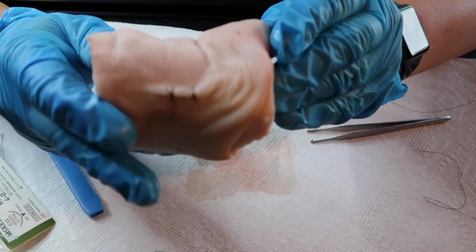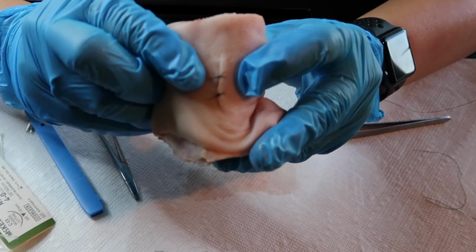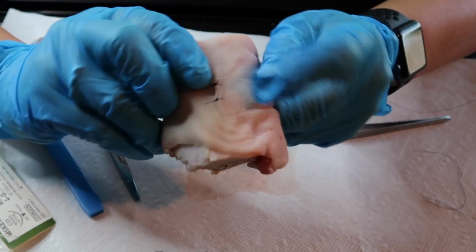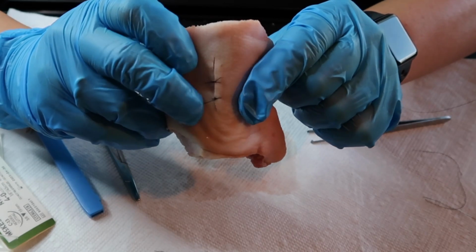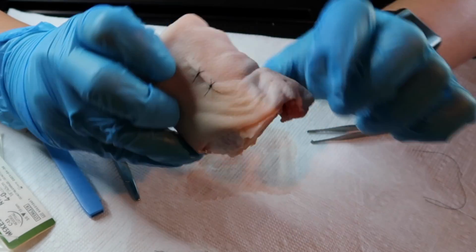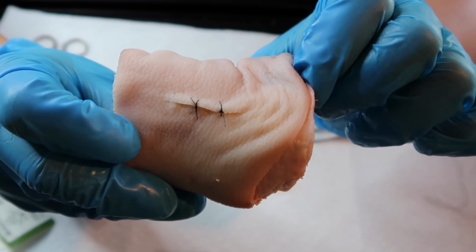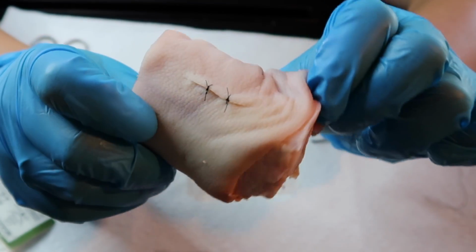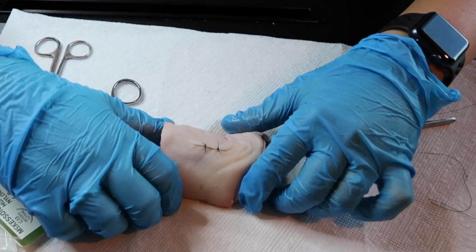So as you can see, we've got our internal sutures and our external simple interrupted sutures here. Ran out of stitch, so I probably would have done 1 to 2 more stitches on each side just to make sure that this stayed closed up, but that's okay. Again, critique all you want, but I'm pretty satisfied with how that turned out. I think with another stitch or 2, this patient would be pretty good and healed up. Those internal sutures would dissolve.